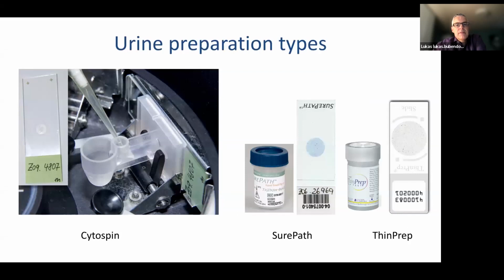Now, cytospins are not the only modality that can be used. Some laboratories, I'll show you some statistic afterwards, prefer ThinPrep, the liquid-based preparation that we also know from diagnostic cytology, or another type of liquid preparation, the SurePath. These are all equivalent to each other. It always depends on how you have been educated and what's your daily practice, and you get used to your daily practice.